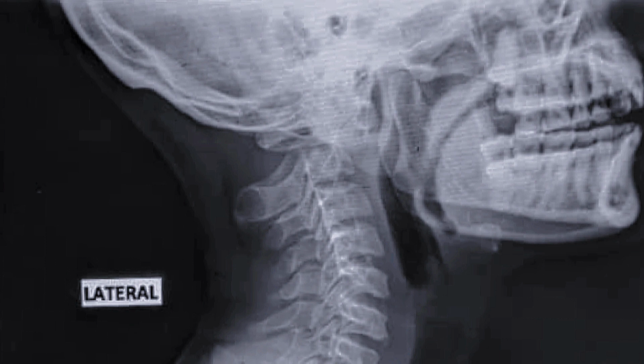These are the denser parts in a human body, they are really dense, so they are going to absorb a lot of energy, right? So just to give you an example, the bones. The bones are going to absorb a lot of energy, which means the image is going to appear white. Where there is a bone, it's going to appear white, right?